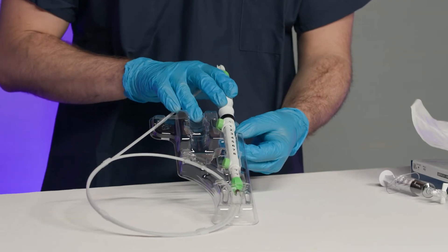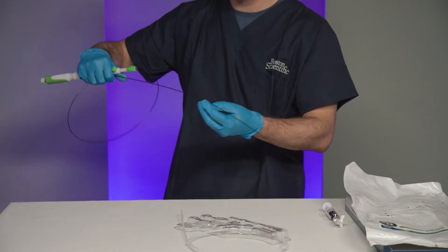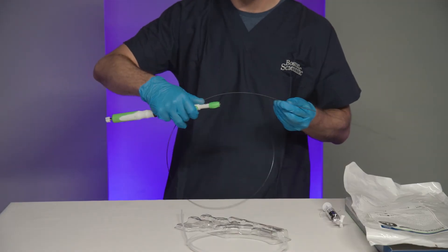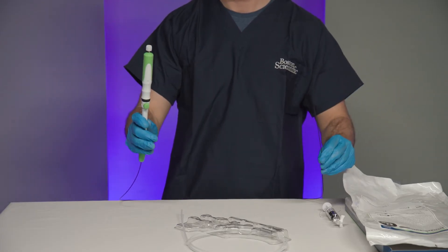Remove the needle from the package and visually inspect the device for loose, bent, or broken parts, cracks, or other abnormalities. Inspect the catheter for any kinds of other damage.